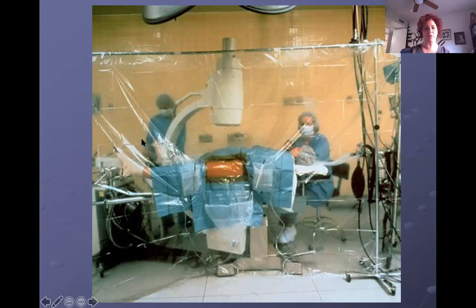So this is all folded up really nice and neat with just this big sticky side out. And it has a little paper on it. You pull that off and you stick it to the incision site, and then it gets opened up, goes over the shower curtain rod, if you will, and then unfolds down to the ground. Okay, so this is an example of a gigantic isolation drape. Does that excite anybody other than me? Orthopedics is one of my favorites, so.